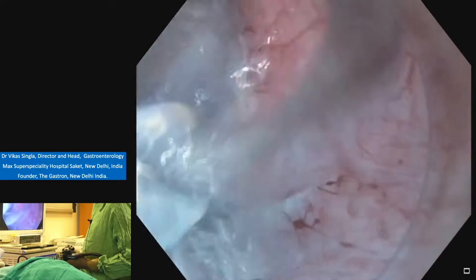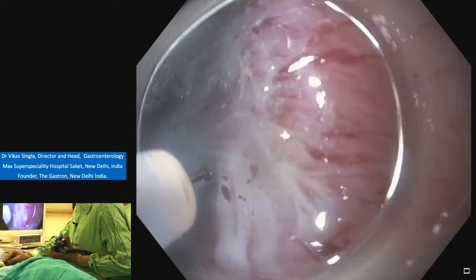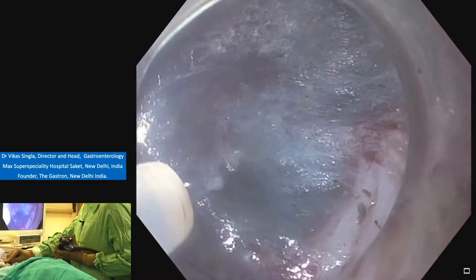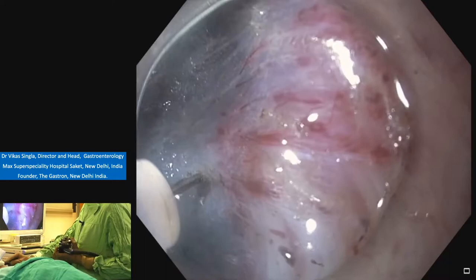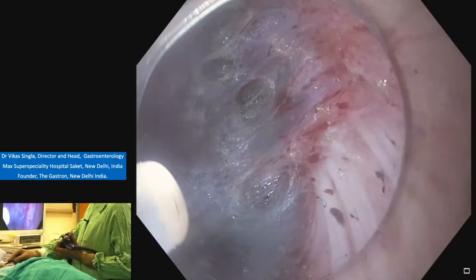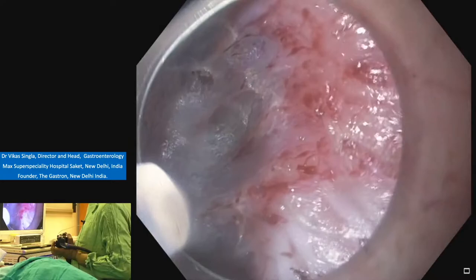So again, inject, and then dissect. One has to be very careful, there may be some hidden vessel there. Very carefully cut fiber by fiber. And some vessel there, yes, avoid the vessel. Yes. So you can see a number of vessels there.